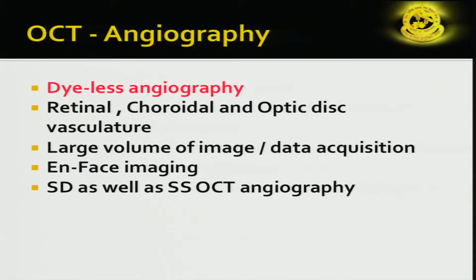So just to give you a brief overview, what is OCT angiography? It is a dye-less technique where we don't have to inject any dye and still we can get the vasculature information about the retina, the choroid and the optic disc.